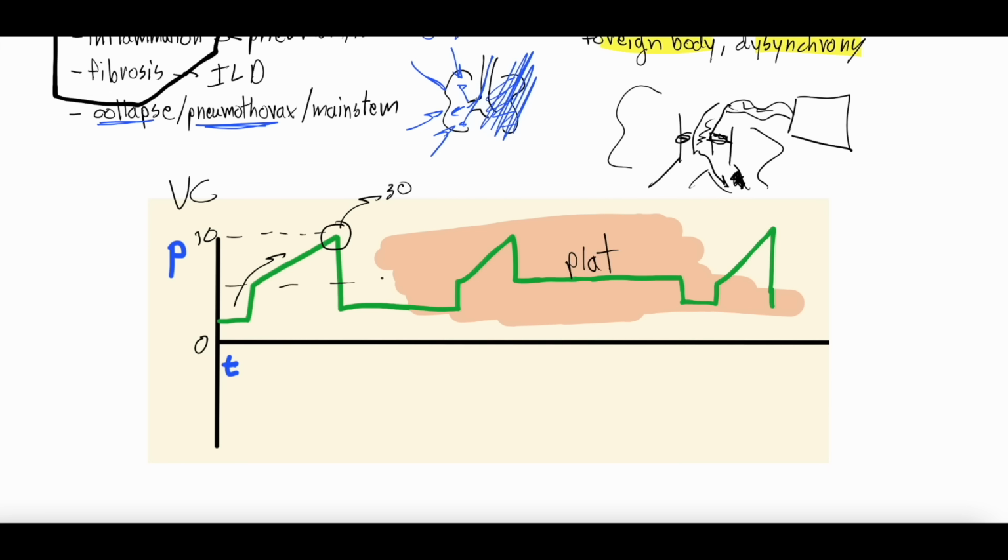So that is literally on the scalar will give you a pressure. You know, if this is 30, let's say maybe this is just 20. Nice normal plateau pressure. And it will kick this out on the screen too. There will be a little area that says plat, and then it'll give you a number like 20. But you have to do the inspiratory hold, right? You have to hit the button. And our respiratory therapist will do this. Certainly shouldn't be doing it too much on the ventilator without the respiratory therapist, especially if you're early on in your training. But you have to do an inspiratory hold to get the plateau pressure, whereas the peak pressure is just that peak pressure at the end of each breath, and that's an automatic thing the ventilator reads.